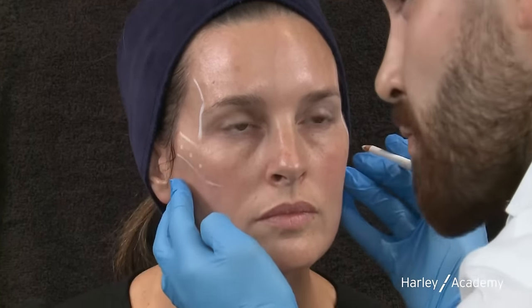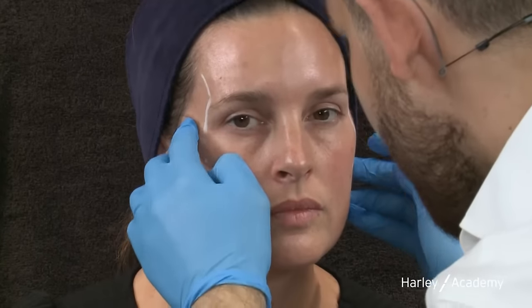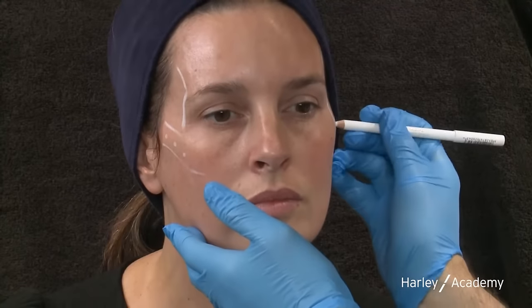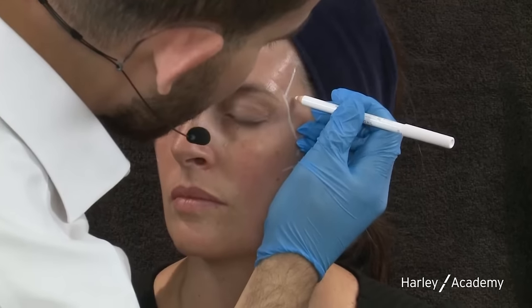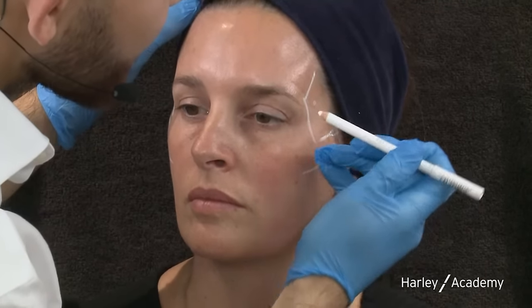It's really important to get symmetry right when starting out. You can really tell after treatment when you look at them from the front whether the boluses are equal. Spending a lot of time marking up is key — the injecting is almost the least part; the majority of time should be spent marking up and making sure things are equal. I always show patients the mirror before treatment and explain they're not perfectly equal to start with, because patients will always notice that — which is why your four photos are so important. Deep on bone in the temple is my target, with deep temporal vessels far posterior and the superficial temporal artery lateral.